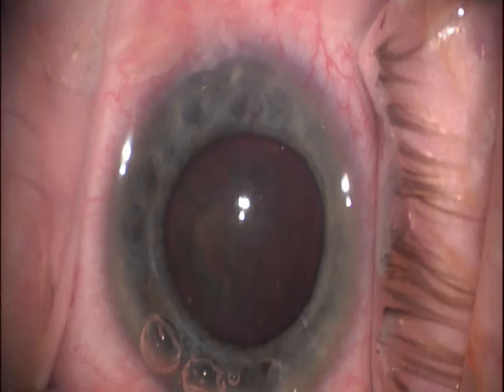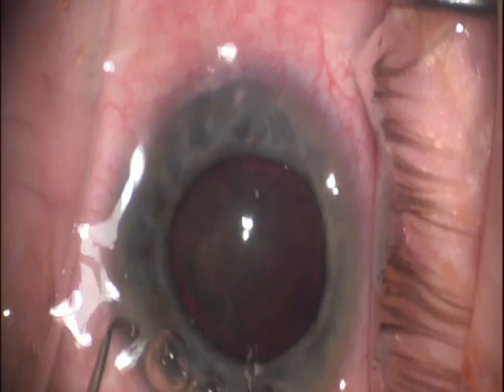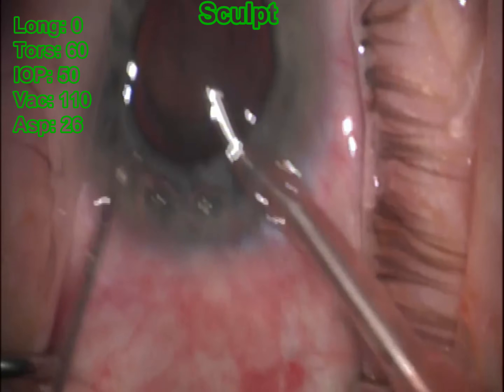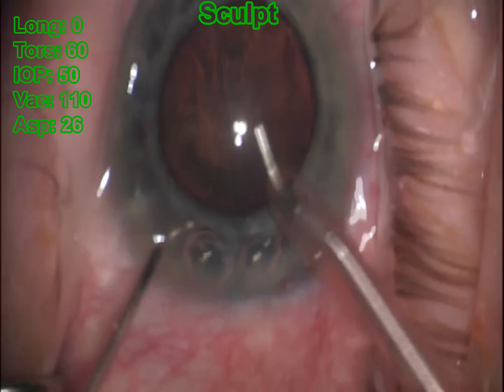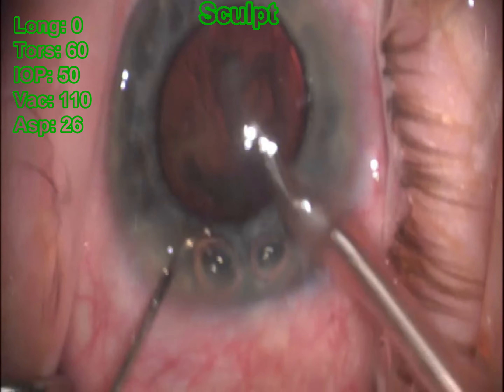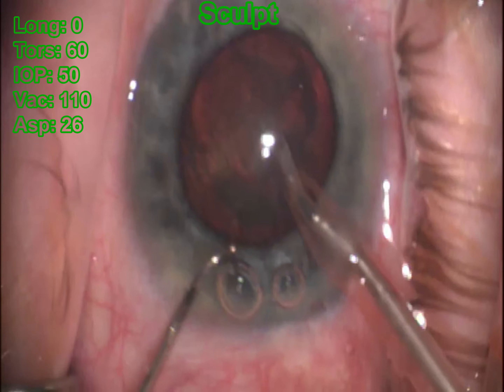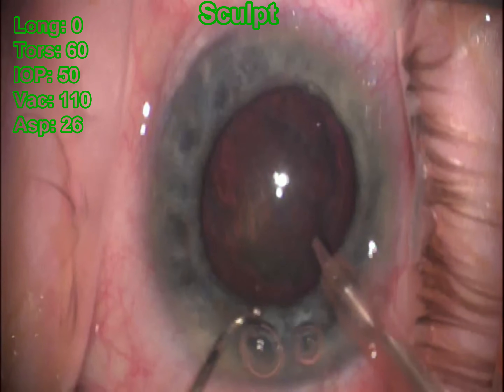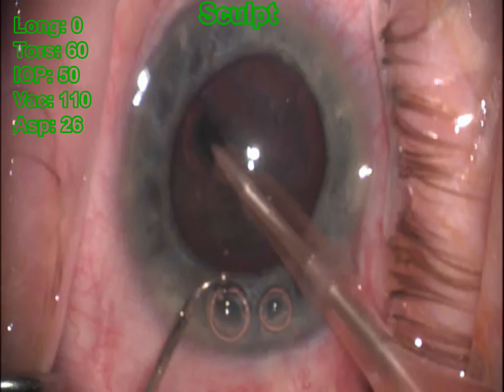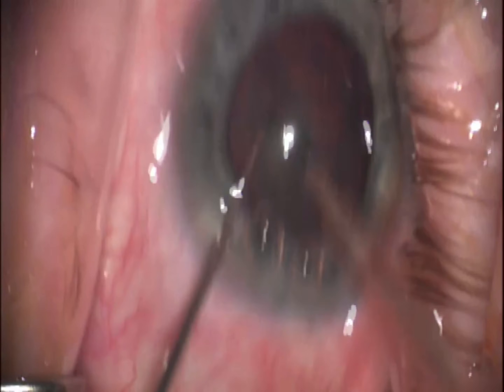Here I am bringing in our FACO handpiece. The way I like to work on most of my cataracts is to create a central groove and do more of a stop-and-chop technique. I just like to debulk the anterior aspect of that cataract, then create that central groove. I use a Connor wand as my secondary instrument because it has a nice dull, bulbous tip, and I don't have to worry about it ripping through the capsule.